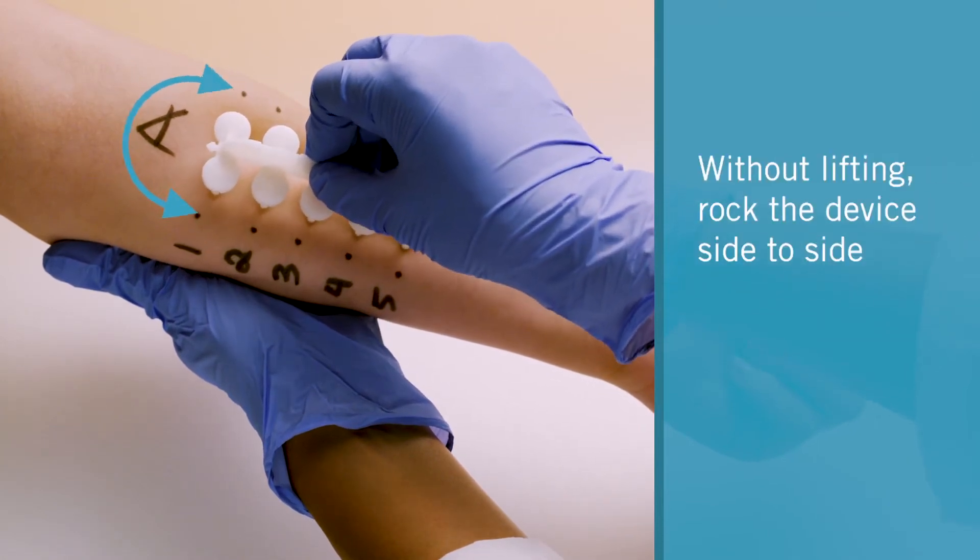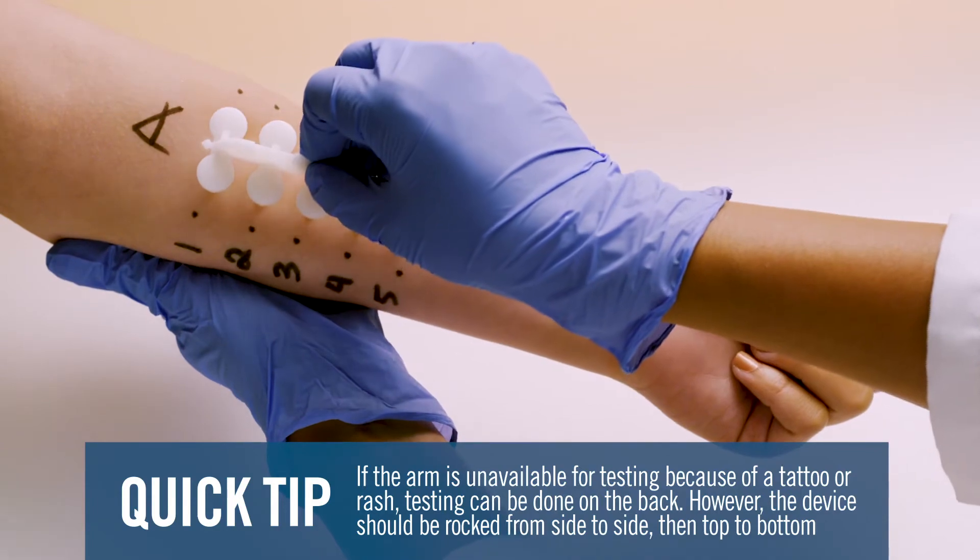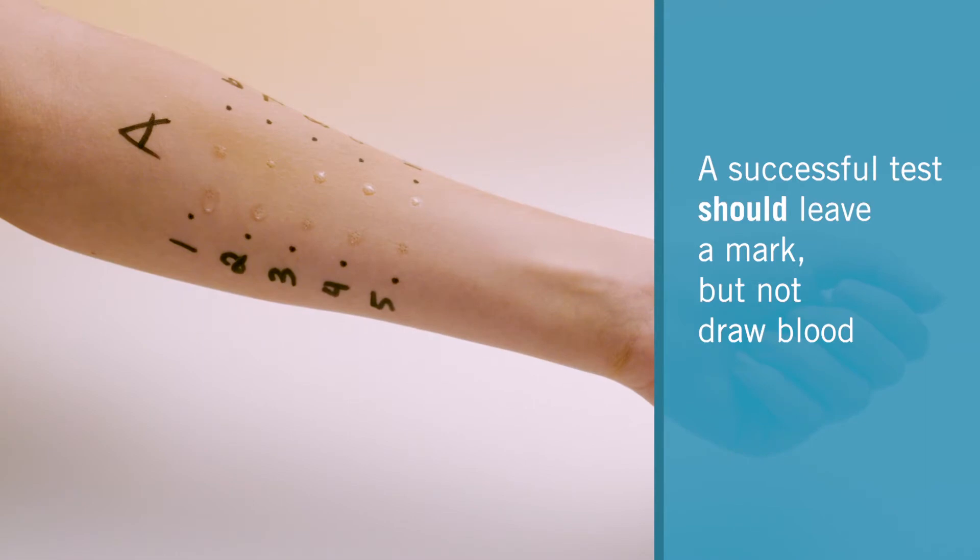Without lifting, rock the device side to side. A successful test should leave a mark but not draw blood.